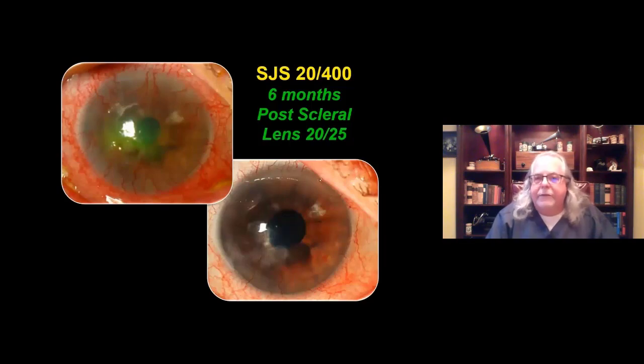Now, the only medical therapy that this patient was on was the saline trapped beneath that contact lens, that preservative-free saline. It just goes to show you the response of many of these corneas with severe ocular surface disease, the virtual miracles that take place beneath these lenses in surprisingly short periods of time.